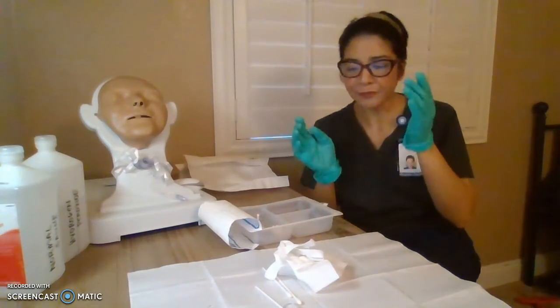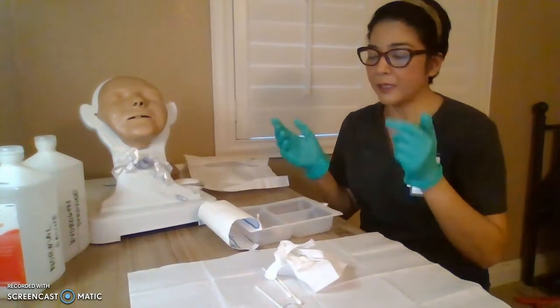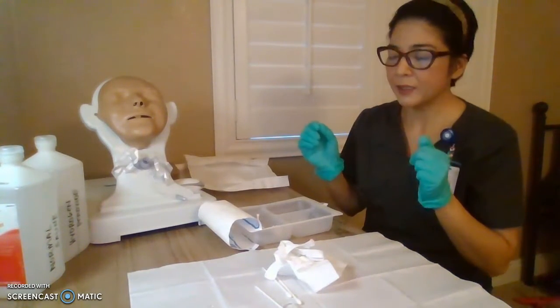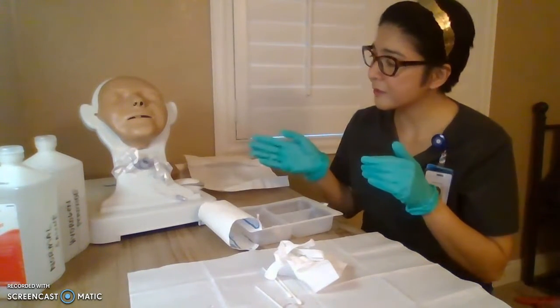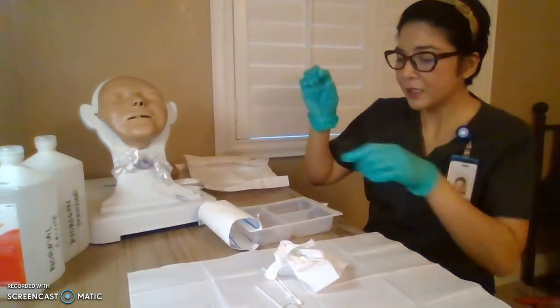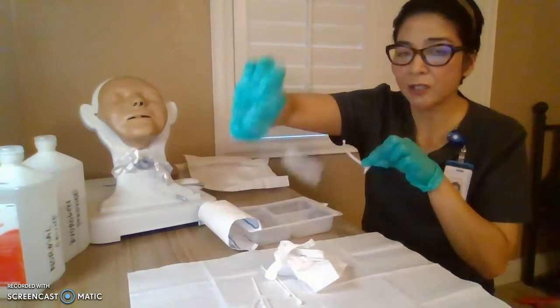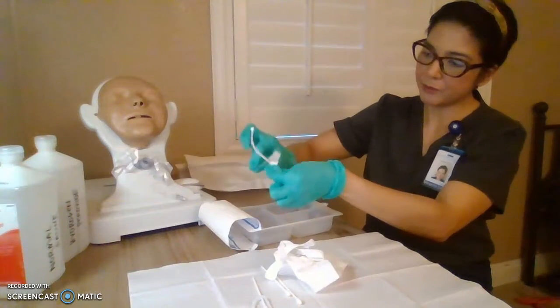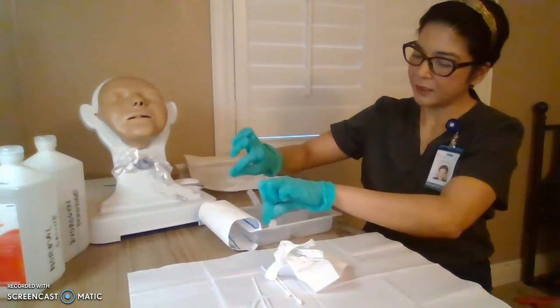Okay, move it. So now I'm going to keep my dominant hand sterile and then this one clean, touching the dirty areas. Okay. So now I'm going to clean your inner cannula. Are you okay, Mr. Smith? Are you doing okay? So now we take our inner cannula. We are now going to clean. We take our brush, go inside the tubing, brush outside on the sides, inside.